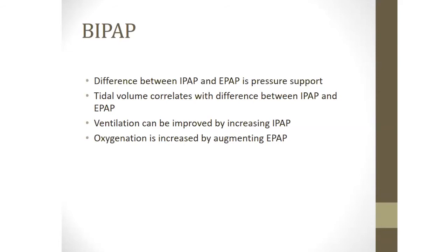And that's the benefit of BiPAP. That's why it improves ventilation and oxygenation too.